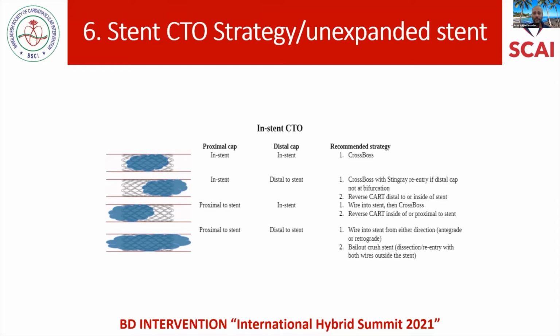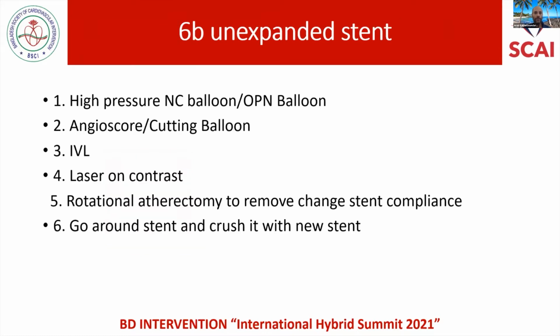Now, with epicardial, the only thing that I'm going to tell you is that you do not dilate it, and you've got to be much more respectful.